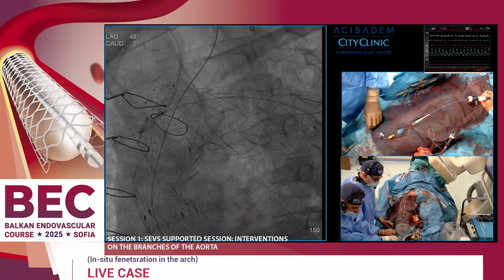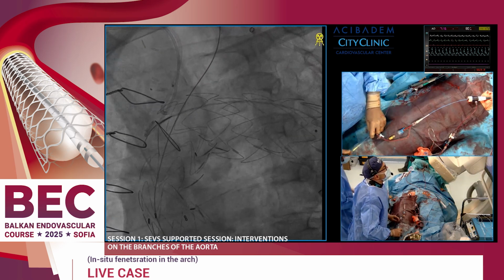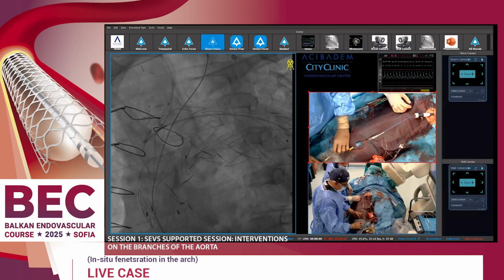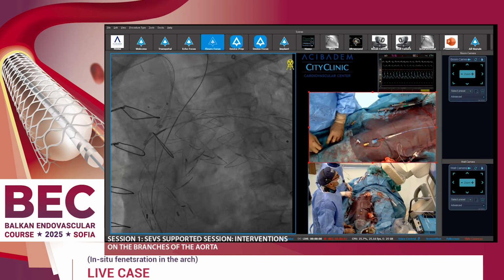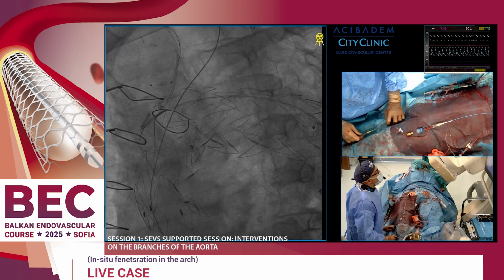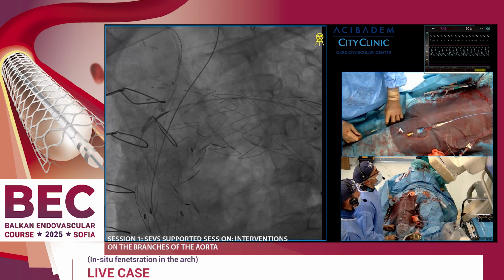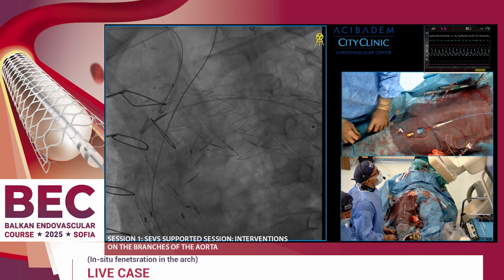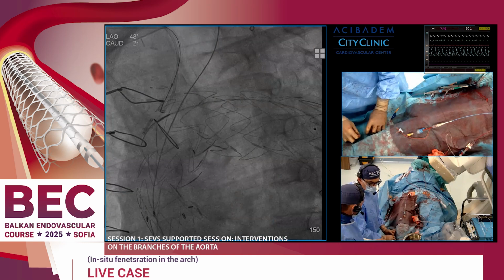Let me feel the point of the micro. Okay. And the wire. Okay. Ready? Go. Yes.